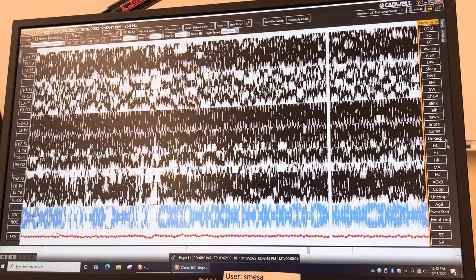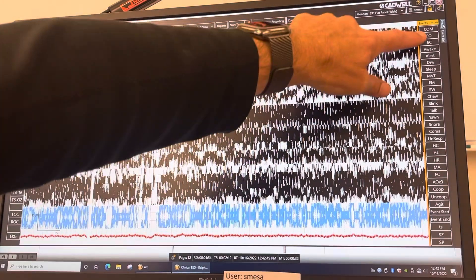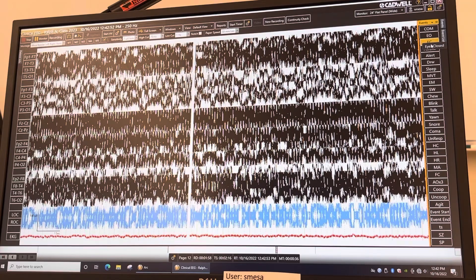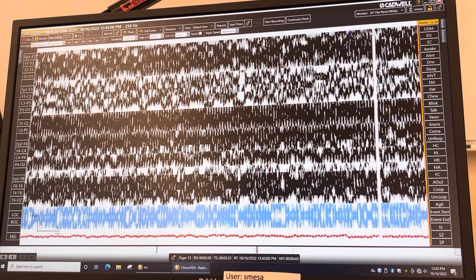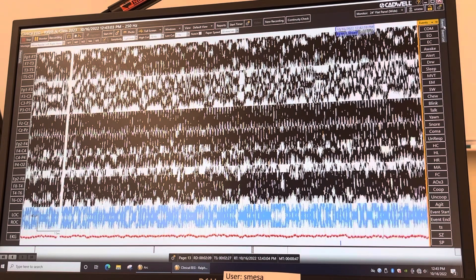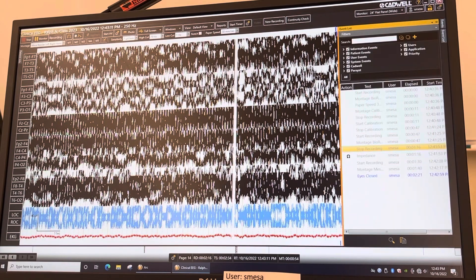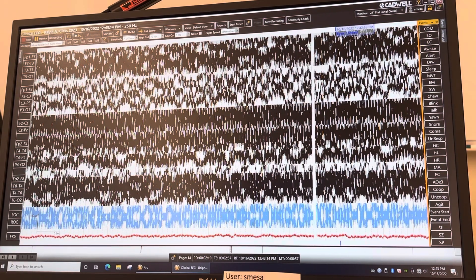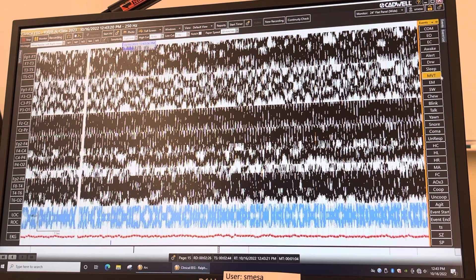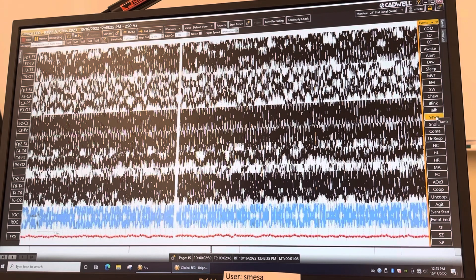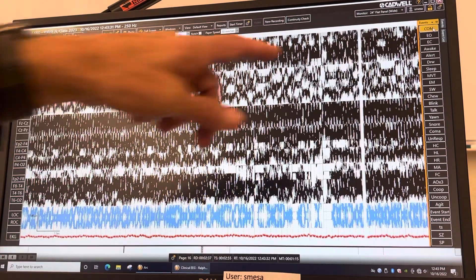Go to Events right here and click on it. At the beginning of each montage you indicate whether the eyes are open or closed. If you hover over the options it'll tell you what they are — click 'Eye Close,' then click once and place it wherever you want on the screen. Then click 'Awake,' move the cursor to the screen, click again, and then add 'Supine.'